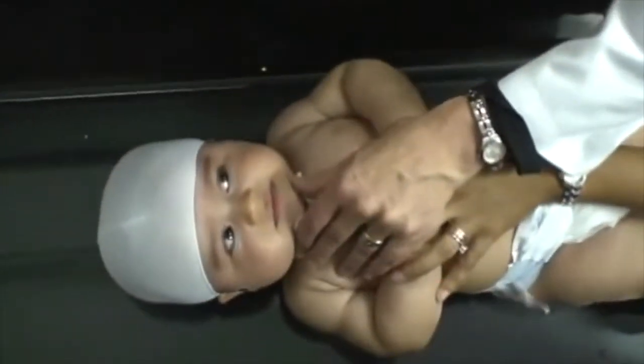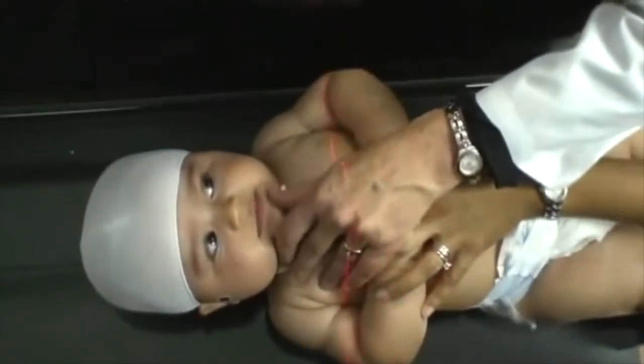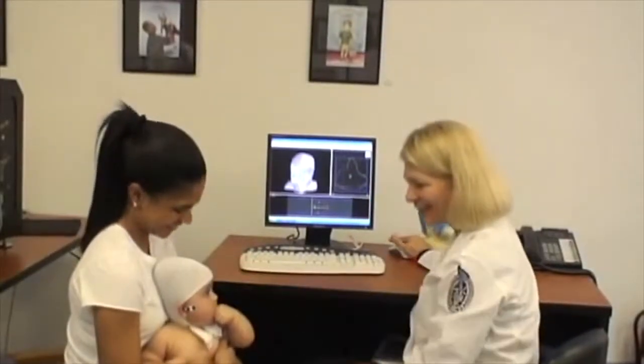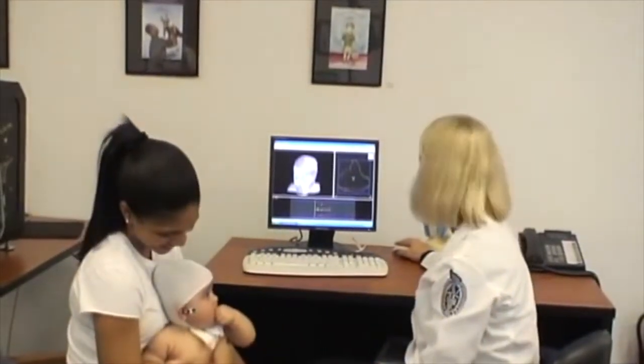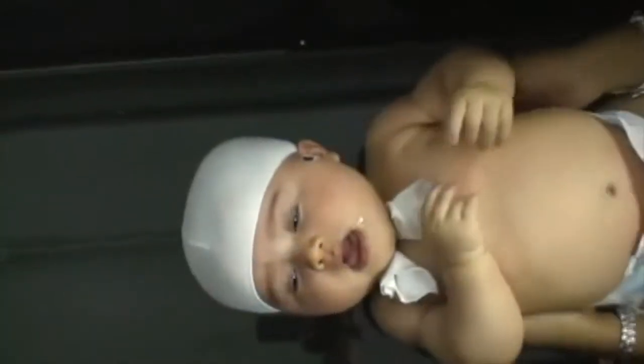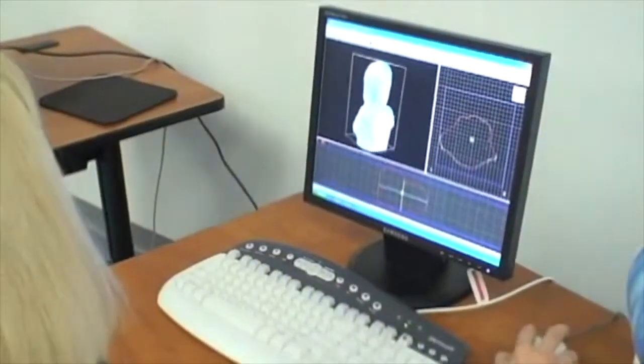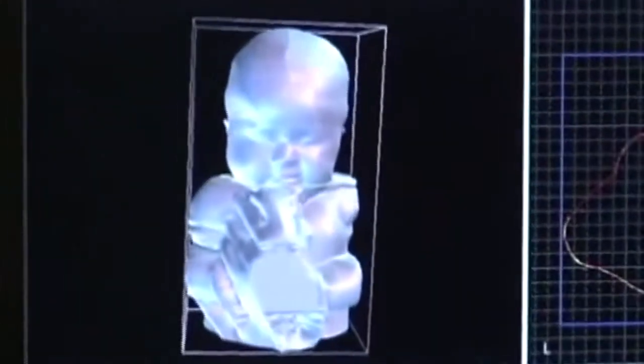The Star Scanner uses class one eye-safe lasers and was the first laser scanning system to receive clearance from the FDA for the use of scanning infants' head shapes. Scans are fast, taking less than two seconds to complete, and are extremely accurate, up to 0.5 millimeters.